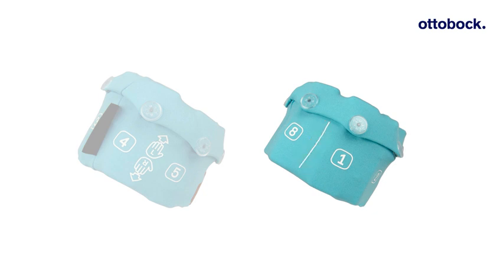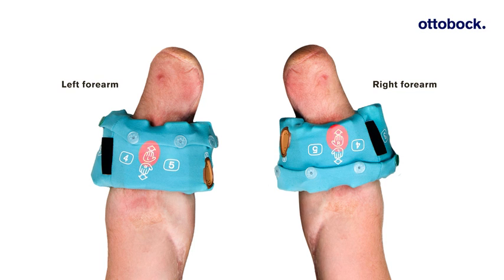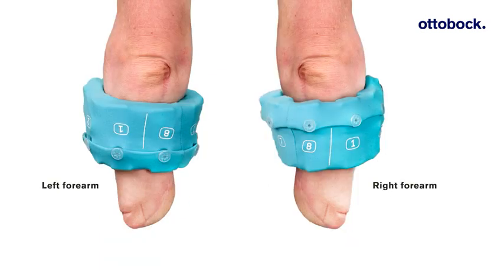Place the Myo Cuff with the new textile in such a way that the hand symbol is legible from the user's point of view. Then, rotate the Myo Cuff so that the ulna lies between electrode numbers 1 and 8.